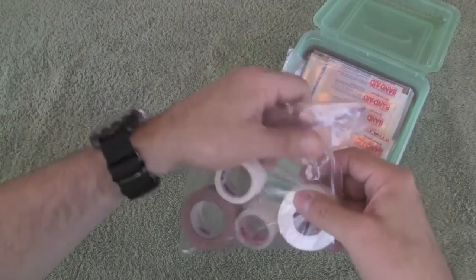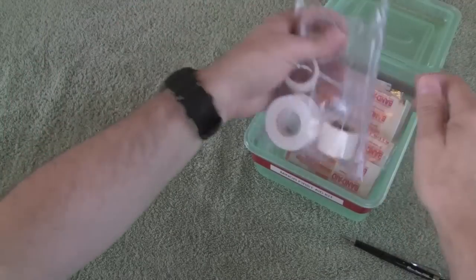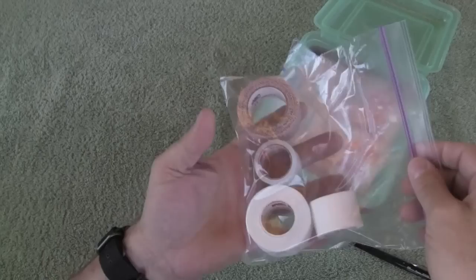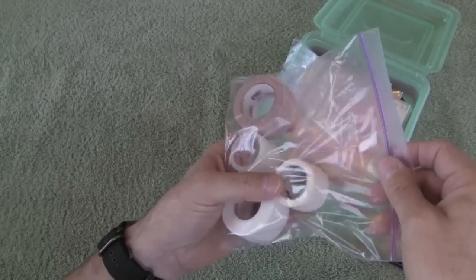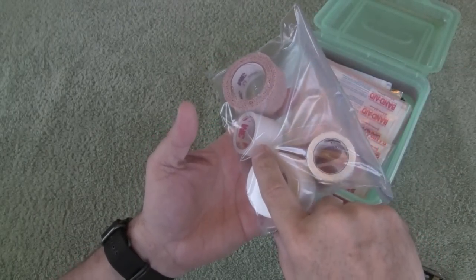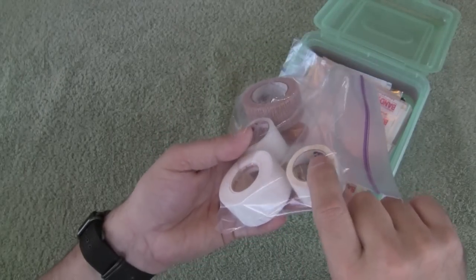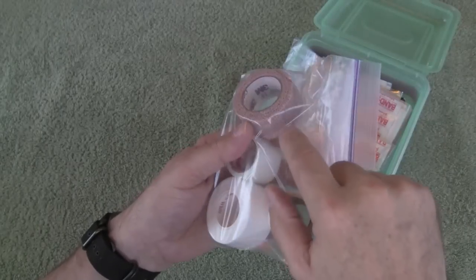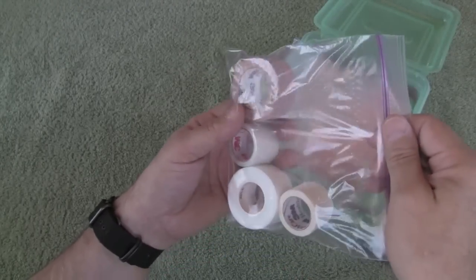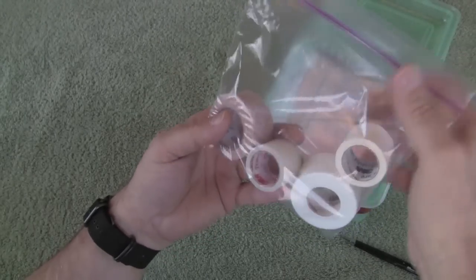When you open it up, you don't have to put these in plastic bags — it just makes it easier to pull components out and use them and then put them back. The first bag has tape, and basically there's cloth athletic tape, some perforated or micropore plastic tape, a smaller roll of athletic tape, and a small roll of self-adherent stretch tape — Coban is one name. So that's in that bag.